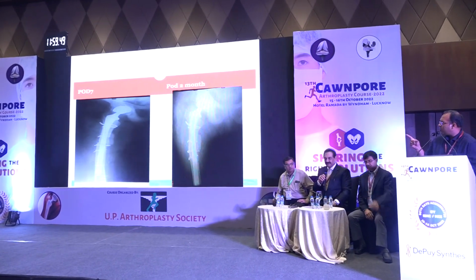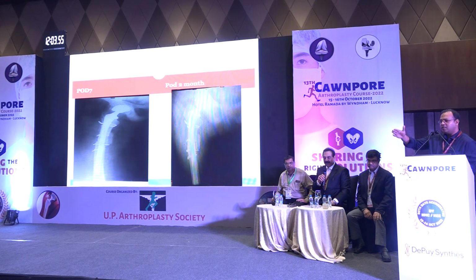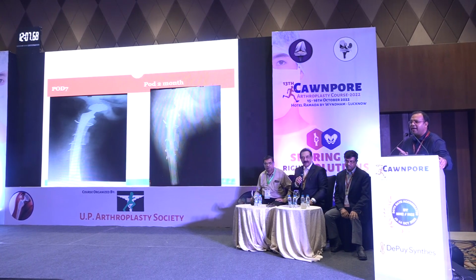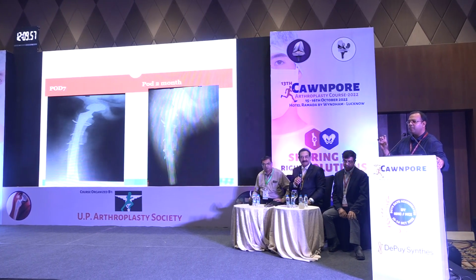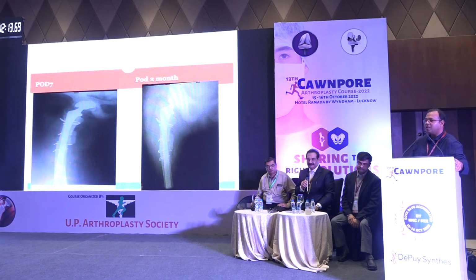So this looks a little varus. The stem has gone towards varus because of the bone loss at that side. I had reamed it centrally when I put it in, but somehow when I put the stem in, it went into this orientation.